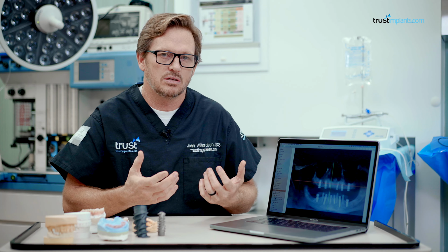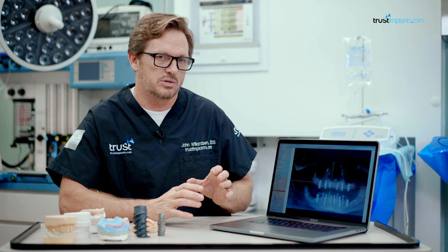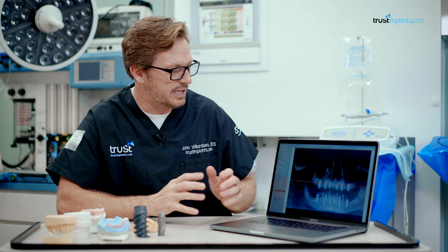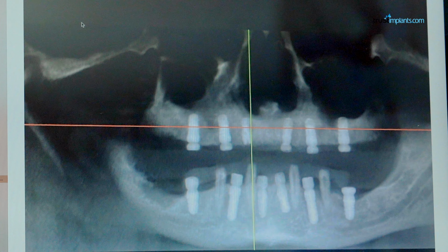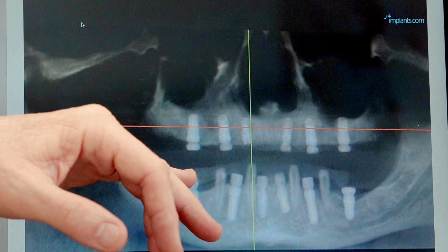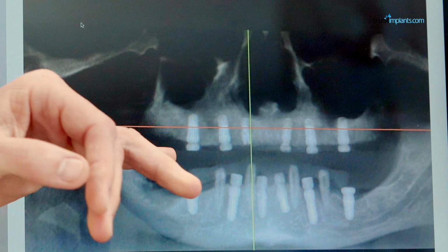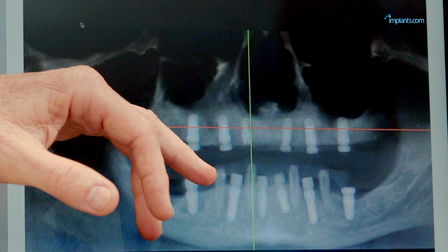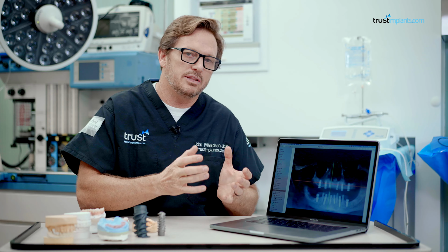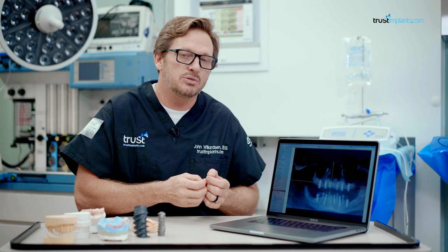And we do immediate loading all the time. But in this case, my torque values were not high enough to put an immediate loaded case on these implants. So I left these natural teeth in, which I'll be extracting, and made him a temporary on those natural teeth. But you'll notice here we've got six implants on the upper, six on the lower, sinus grafts on both sides. So we're getting on the path to restoring his mouth to as close to what it was like before he lost his teeth.